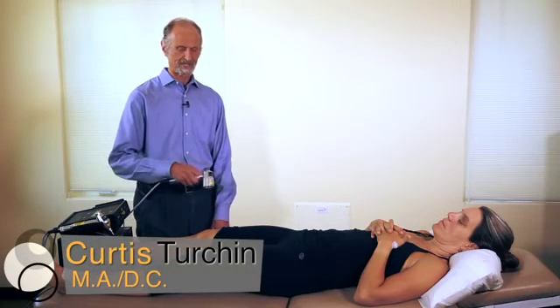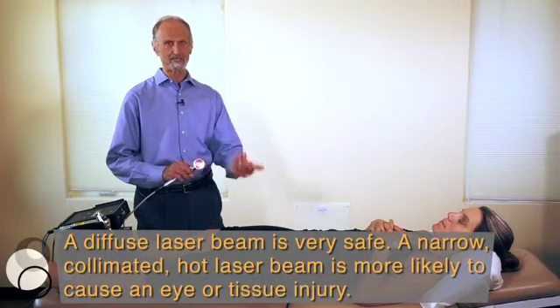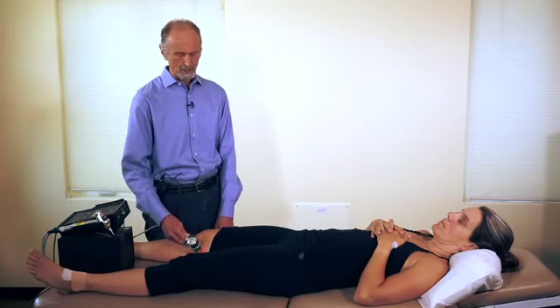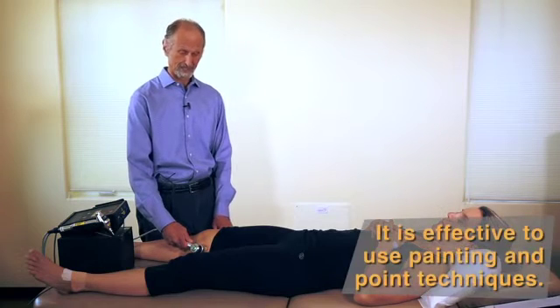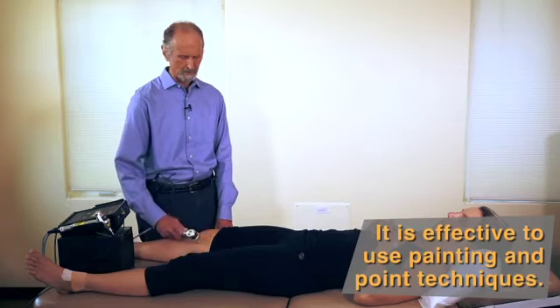If we're using a powerful laser — this is a 5,000 milliwatt laser — you can look at it because it's a diffuse beam. It's very safe; if you're looking at the screen, it's fine. We would put it on an area for probably 20 or 30 seconds, and that will provide very deep penetration because it's got 5,000 milliwatts. It doesn't take a long time. Then we might paint over some more superficial areas.